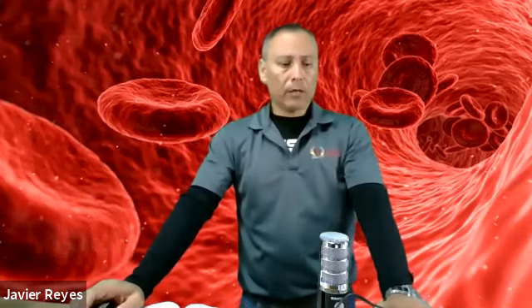Remember that you have to arterialize your site to make sure it's warm so you have good, adequate blood flow. Remember not to collect specimens when they are swollen, when you see redness or an infection, when there's edema or swelling, or if there's any impaired mobility in that hand or arm. Any contraindications for collecting specimens from that arm must be followed, such as history of surgeries, history of mastectomies, and so on. Dialysis grafts apply the same as in venous punctures.